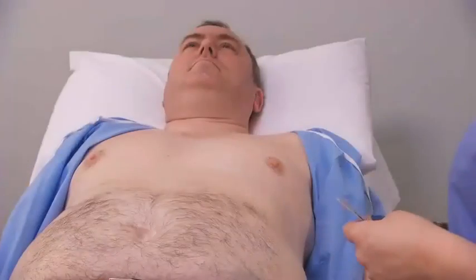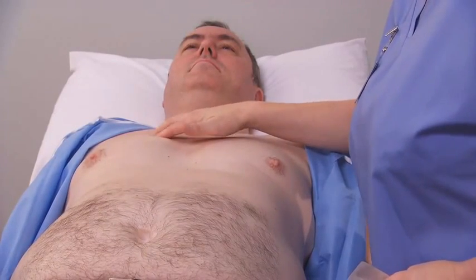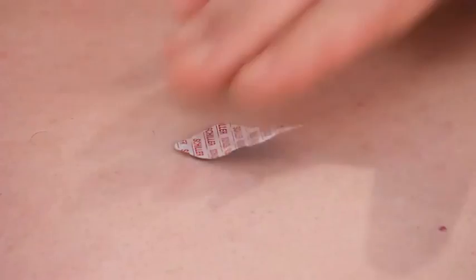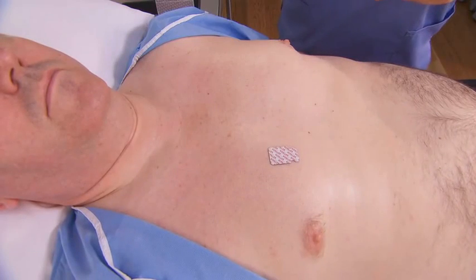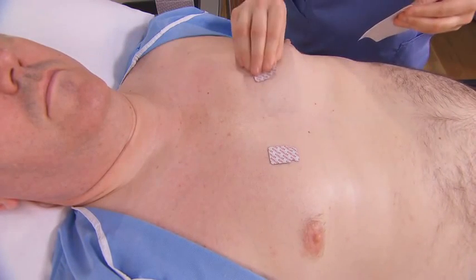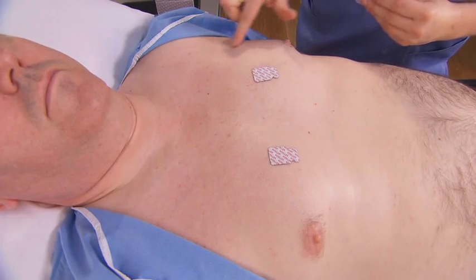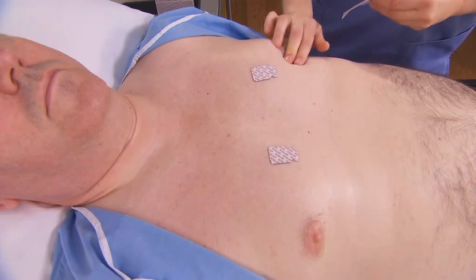Next, apply the self-adhesive electrodes to the chest correctly. Place the V1 electrode in the 4th intercostal space at the right sternal border. Then, place the V2 electrode in the 4th intercostal space at the left sternal border. Next, position the V4 electrode in the 5th intercostal space in the midclavicular line.